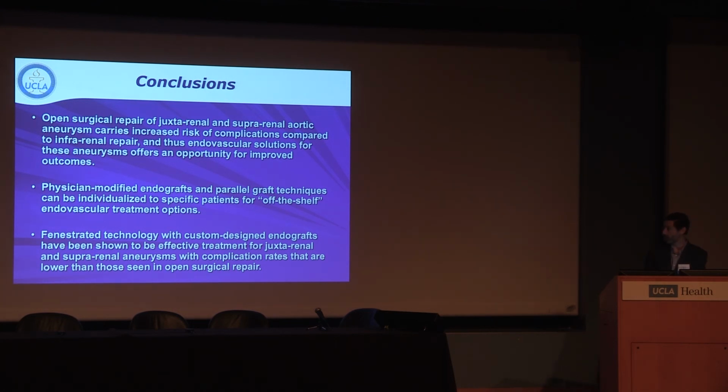Now with the fenestrated technology, with custom-designed endografts that are commercially available, we've seen, again, a trend toward reduced perioperative mortality compared to open surgery, and reduced rates of renal failure and other complications. And I think this is probably going to be an important area going forward in the future.